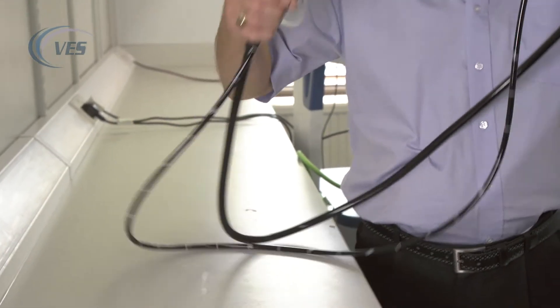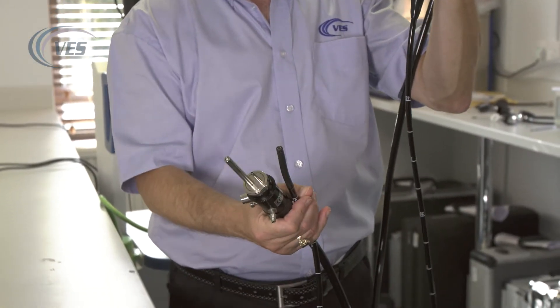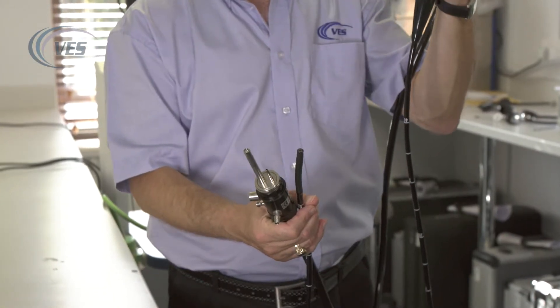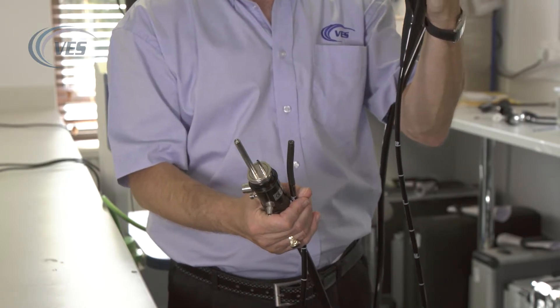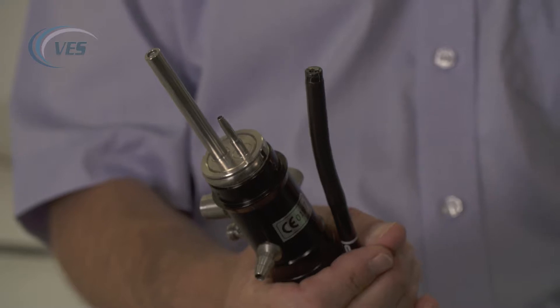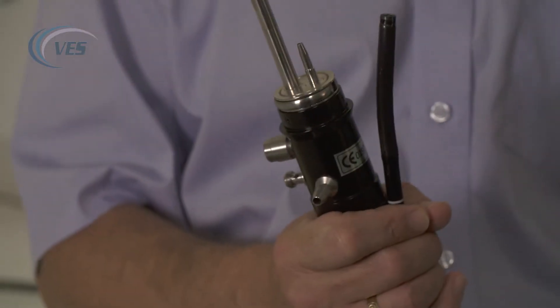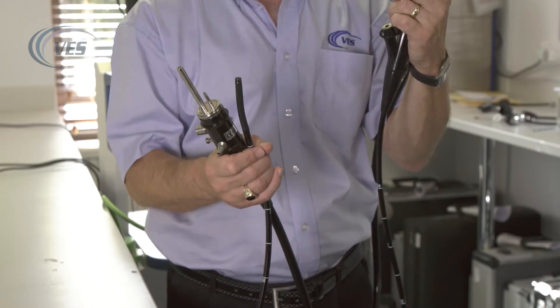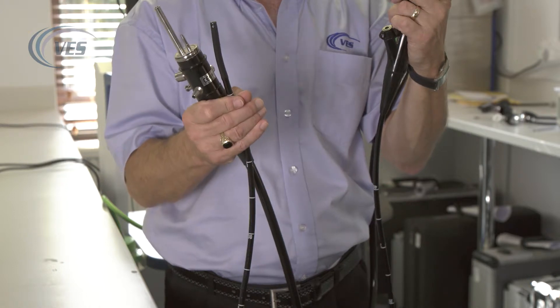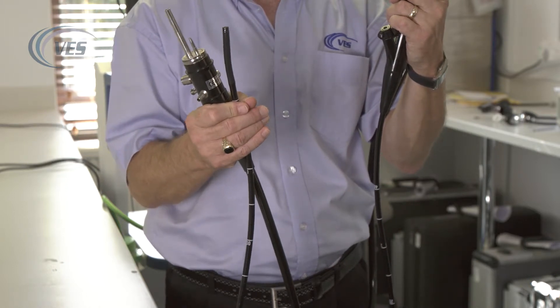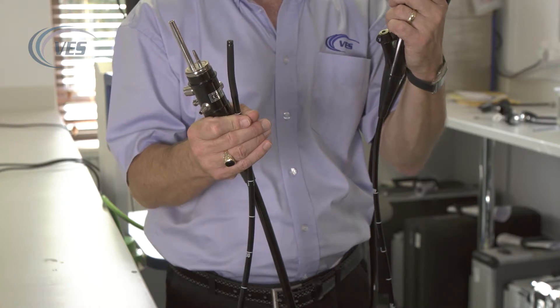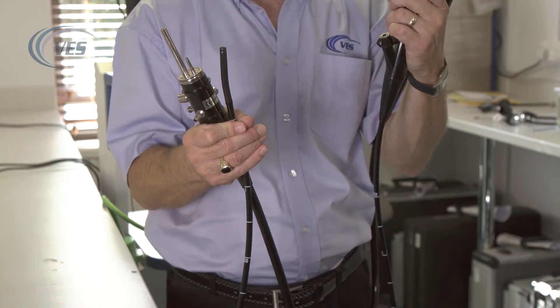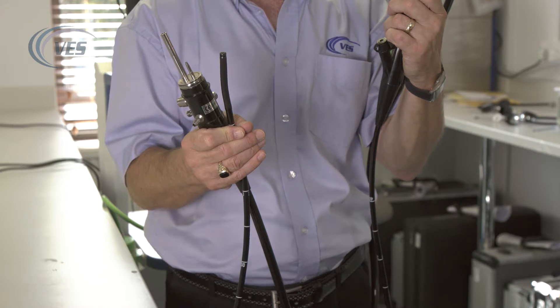Storing the scope ideally is hanging up with the patient tube inside a protective down pipe or drain pipe. If it has to be stored in the storage case, when you put the scope away, make sure that the end of the tip is safely tucked into the case. Don't jam the case on top of the patient tube. You will cause irreparable damage.